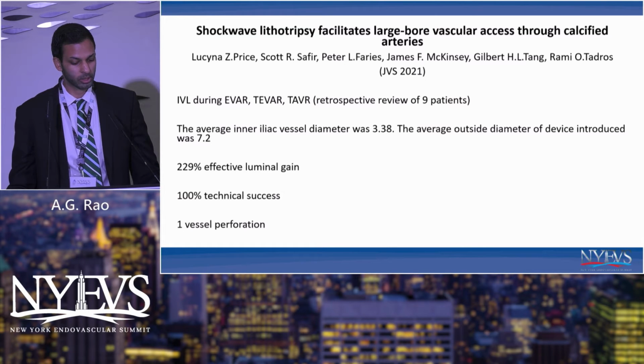They had 100% technical success, 1 vessel perforation, which was managed with a covered stent, and no long-term complications from the access site.